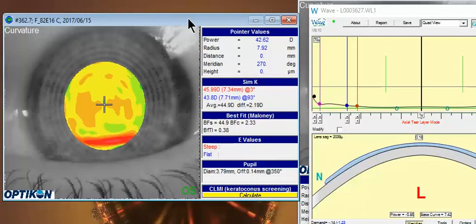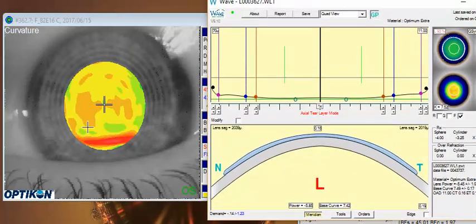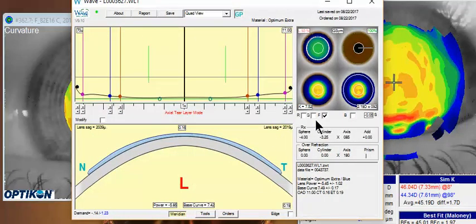But once again, to summarize, I think you've just got a little more complicated optics because you averaged out this cornea and then used a Freeform design on top of that. So simplify, go back and do it without averaging, and then maybe even consider going to a G-sym design. And I think that will help your optics get back on track.